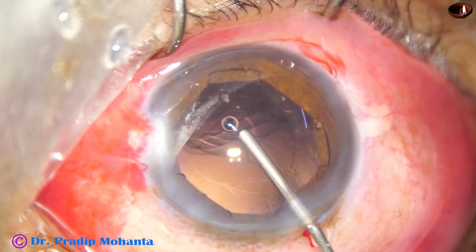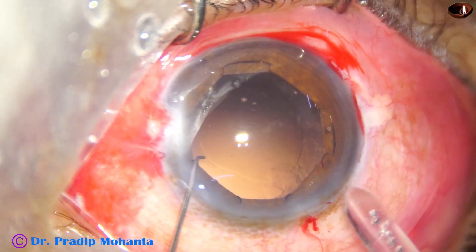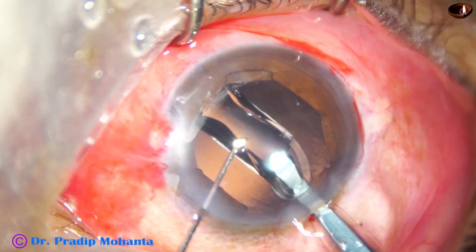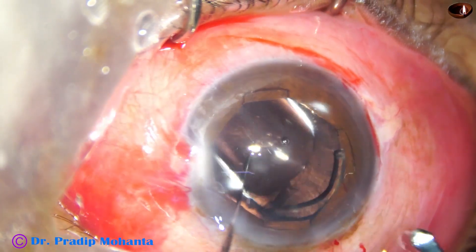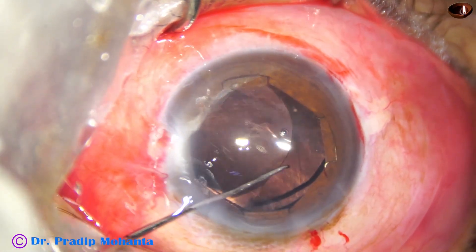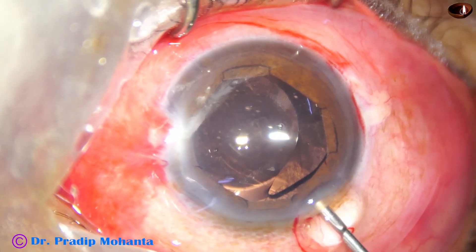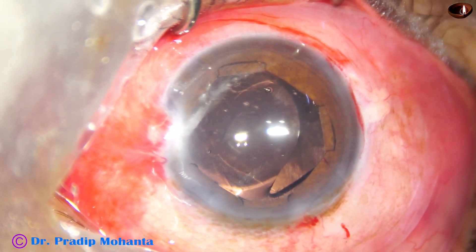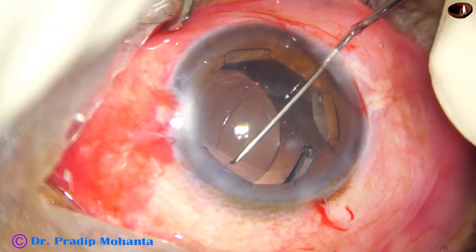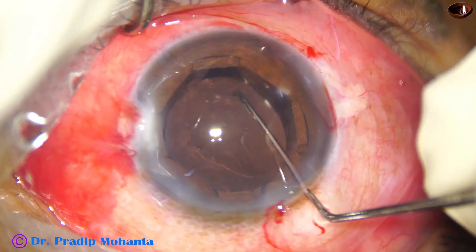Cortical cleanup is done. Visco goes inside and a hydrophobic, single-piece, monofocal intraocular lens is placed in the capsular bag. The haptic is still not fully inside the bag — inject visco, go through the side port, press the haptic-optic junction gently, and then the haptic goes into the bag.